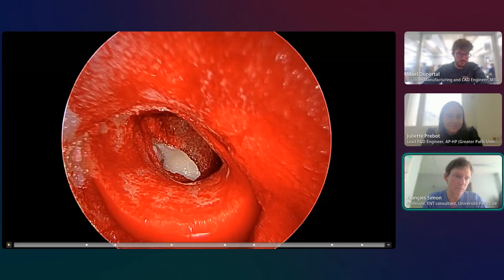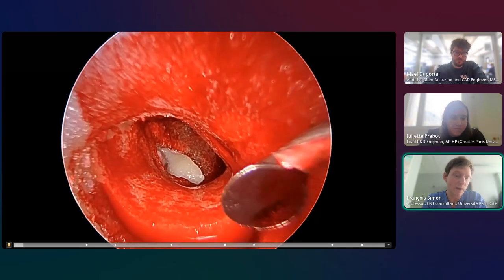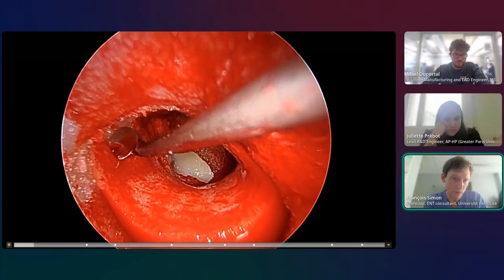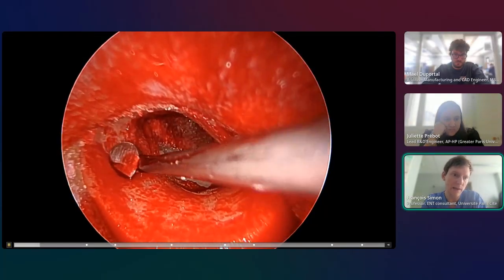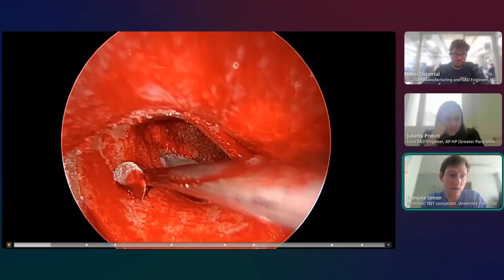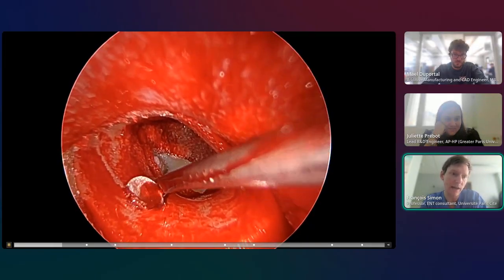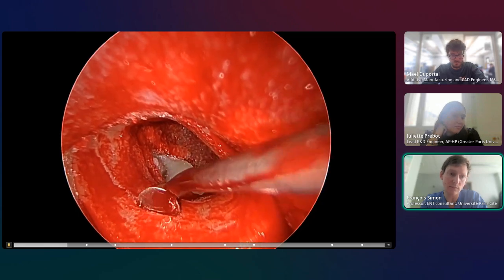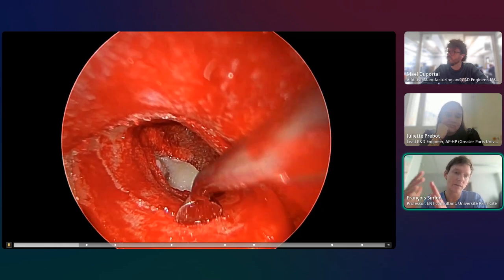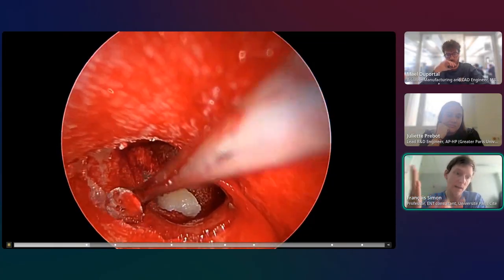So this is a brief video you can play. Thanks, this was a great addition that we had actually. So this is a tympanic perforation. You can see the hole there in the eardrum. We're adding fake blood. It's theater blood, it's not any special blood. And so it changes the texture, so it's much more lifelike. And the flaps and the different anatomical structures can stick to each other like in a real surgery.